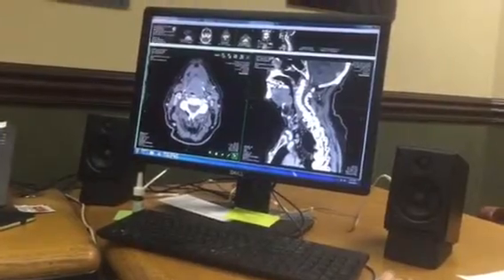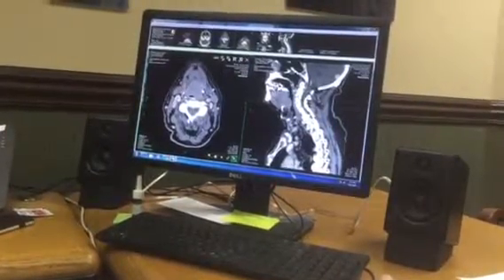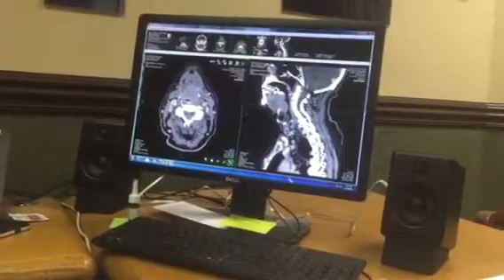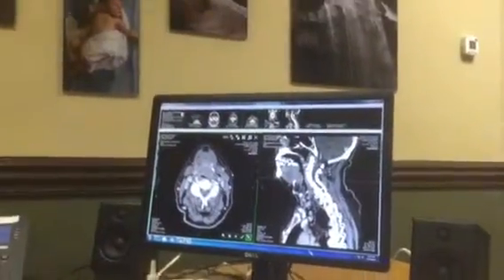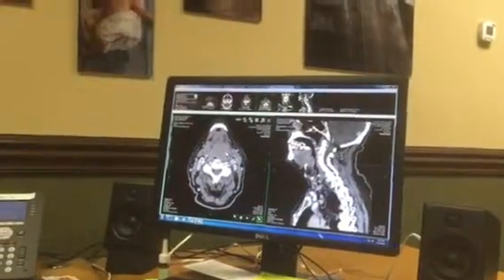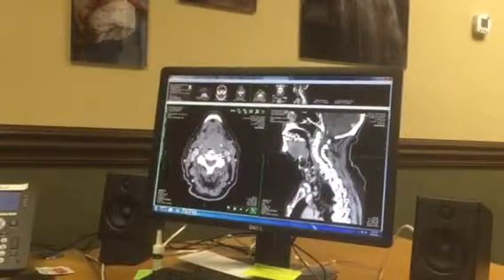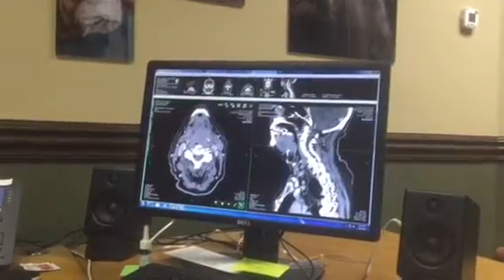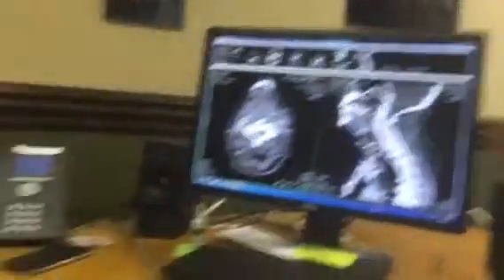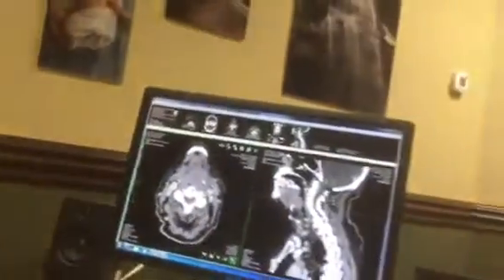It looks like you just have the one node. Here's the jugular vein. Here's a carotid artery. Here's that mass. It's just under the size, bigger than 3 centimeters would make it N2. It's bordering on N2A. You could almost call it T3 N2A, which would probably be the most aggressive that I would label it. That's the mass sticking out there. Yeah, right there. That's the mass.